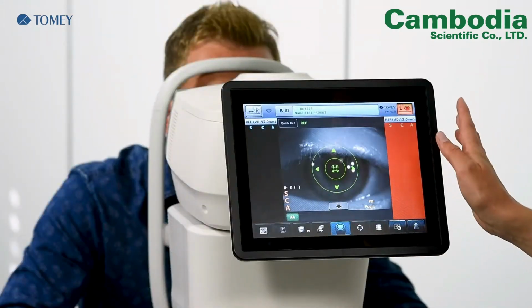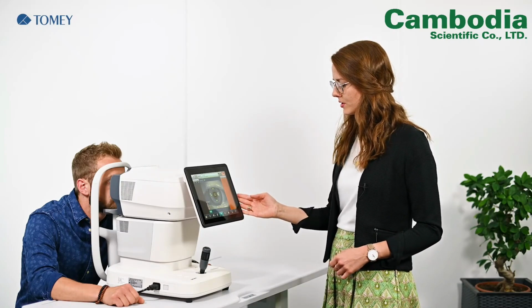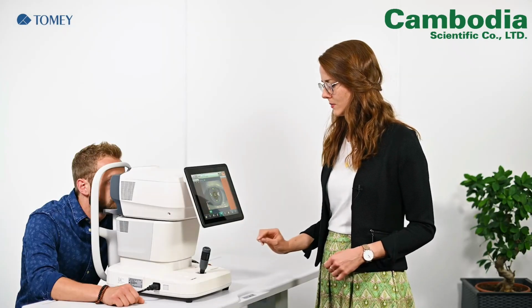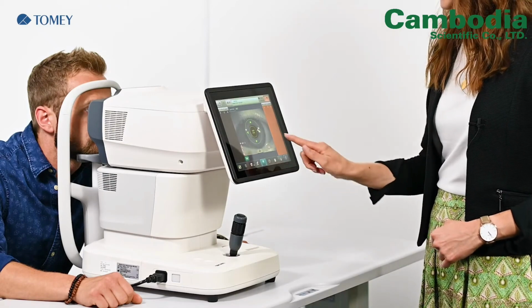In the quick ref mode, the auto shot button is not available because you have to activate the measurement by yourself. Therefore, you can use the measurement button, which is in the display, or the joystick button. So now our patient will pretend to be uncooperative and we will start the measurement.